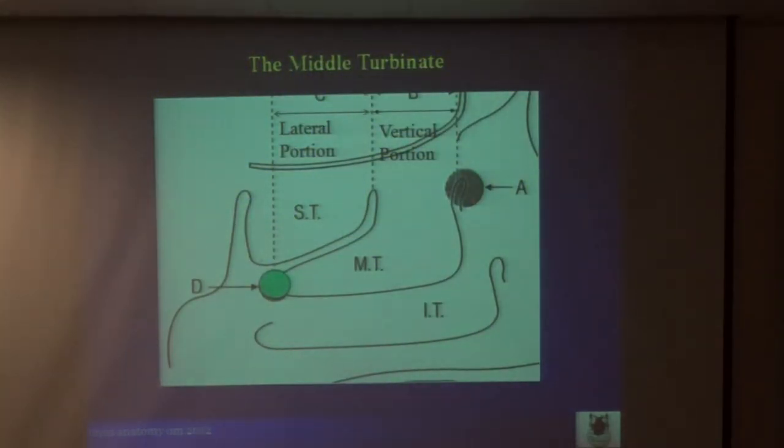So going back into the anatomy, this is a sagittal cut, and when you first look inside the paranasal sinuses, the first thing you're going to see is the anterior part of the middle turbinate. I pay very much attention when I have somebody operating on the sinuses and I'm observing how well they respect the anterior part of this middle turbinate.